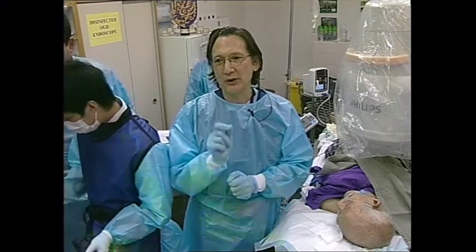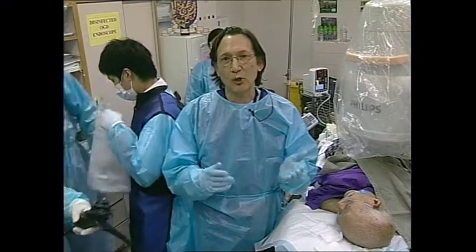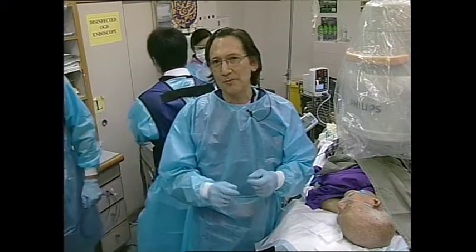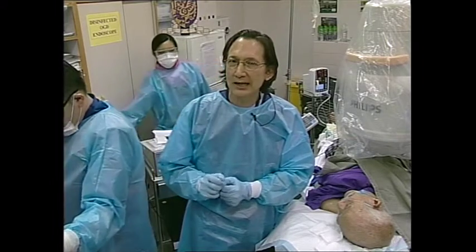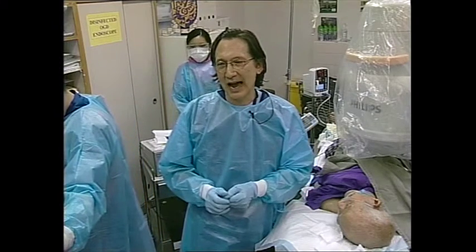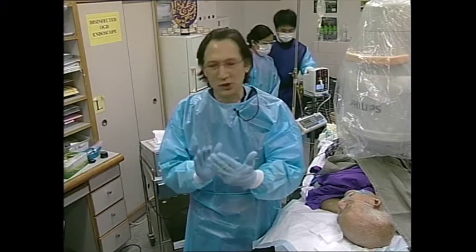That is why you can see some of the endoscopists perform very aggressive tract dilation, sometimes to 20 millimeters with a 20 millimeter balloon, and they don't perforate. And the reason why they don't perforate is because there is good fusion. But if there is not good fusion, then of course you're going to easily have a perforation and leakage. And I have personally inserted stents, not into the pseudocyst, but into the space between the pseudocyst and the gastric wall when there wasn't adequate fusion between the two structures.